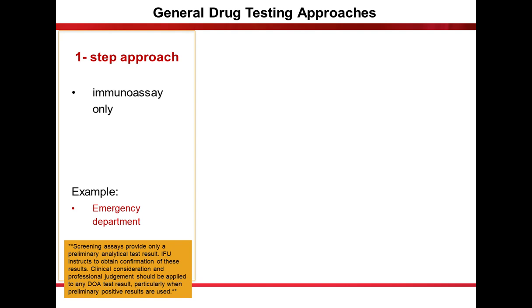That being said, I do have to put out the disclaimer that these screening assays only do provide preliminary results. And so the instructions for use for them do say that confirmation is recommended. So clinical consideration and professional judgment should always be applied to any of these results, particularly when there's a preliminary result that's generated.